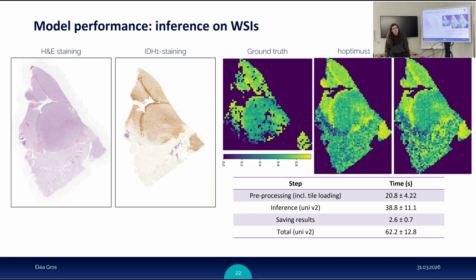Then the only thing is, I don't know until how big you can increase it and run it on a standard GPU. Anyways, the main thing is all these foundation models, the first step that they use in the forward pass is basically to resize everything to 224. So it doesn't matter. You can take a patch bigger. The first thing that they do is resize everything to 224 by 224. So there is not really a point in bigger, I would think. You have to think about the use cases and how we want to put this in a paper so that it gets nicely published.